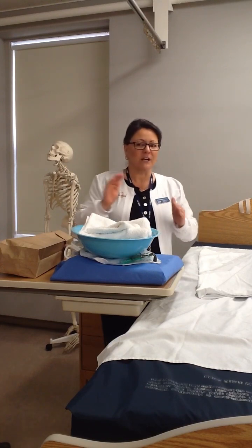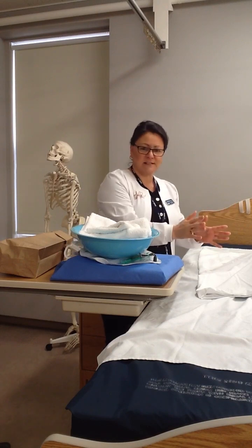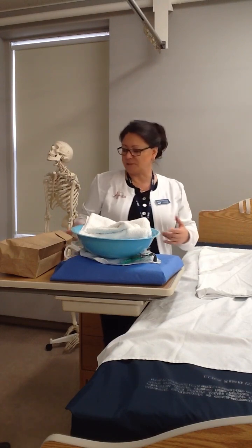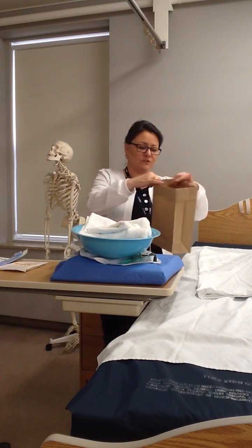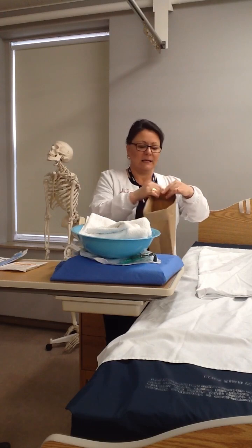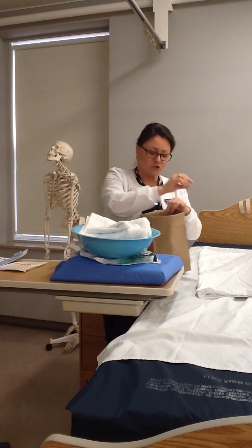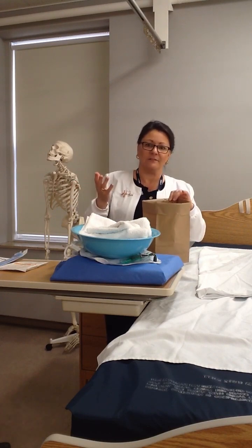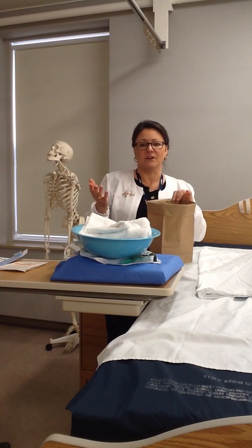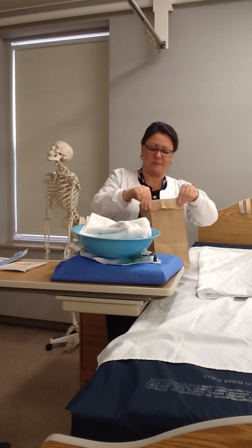Before I do that, I'm going to try and set up everything that I can so that I help Jesse stay covered as long as possible. Again, in sterile technique, you'll hear me talk about turning a cuff down on your paper bag. It's because we don't want it to close in on us when we are dropping soiled things that could have infection and bacteria on them. So we want to maintain that sterile bag or that cuff being open.